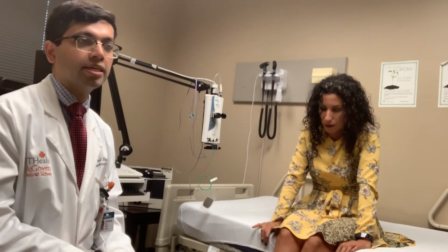Why are you doing the test? What is it that you are looking for? Which nerves should you do, which muscles should you do, and what will you do if you see a particular abnormality in that nerve or muscle? To get that plan of what you want to do with this machine, first you need to have a good history and good examination. That cannot be overstated.